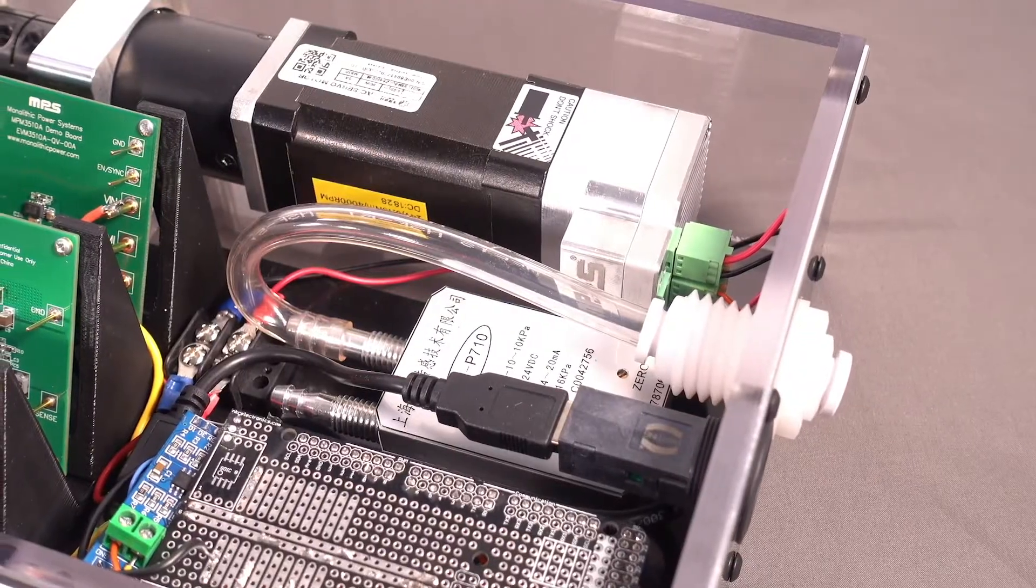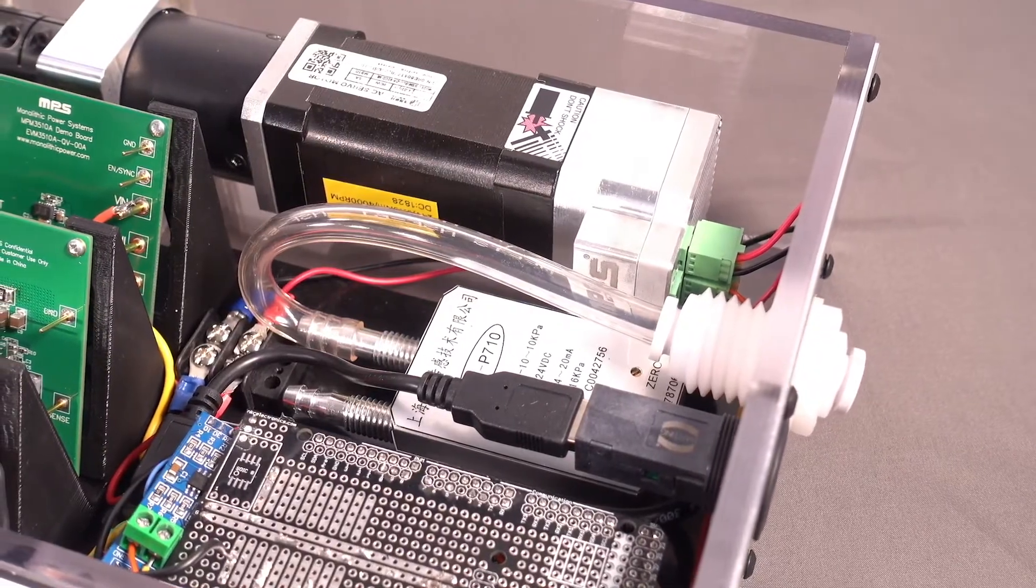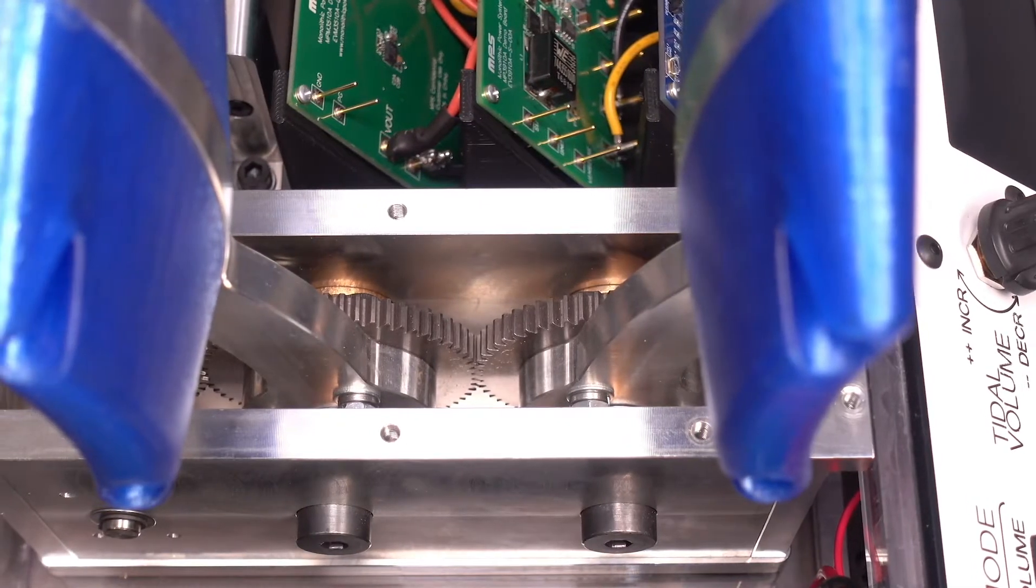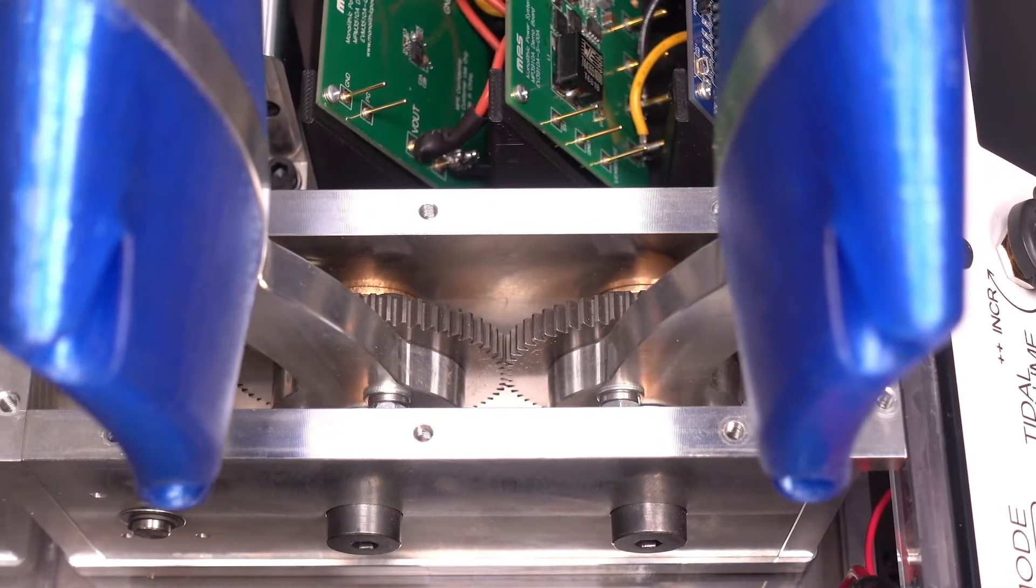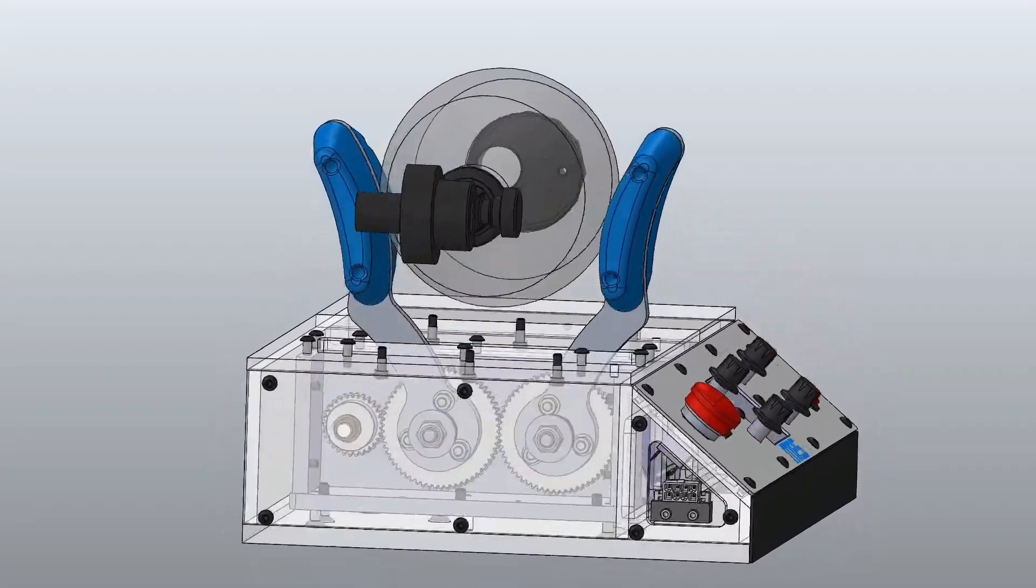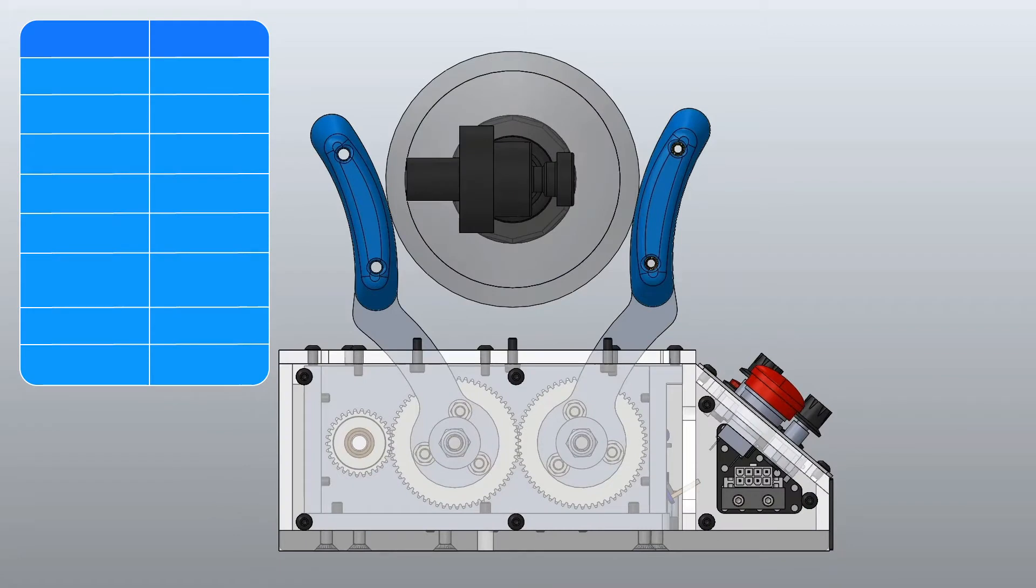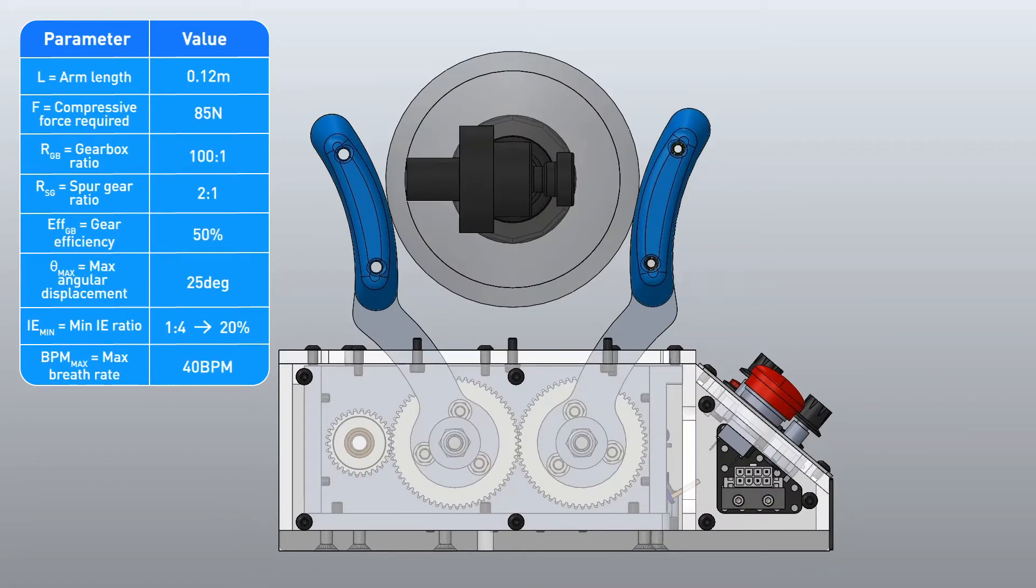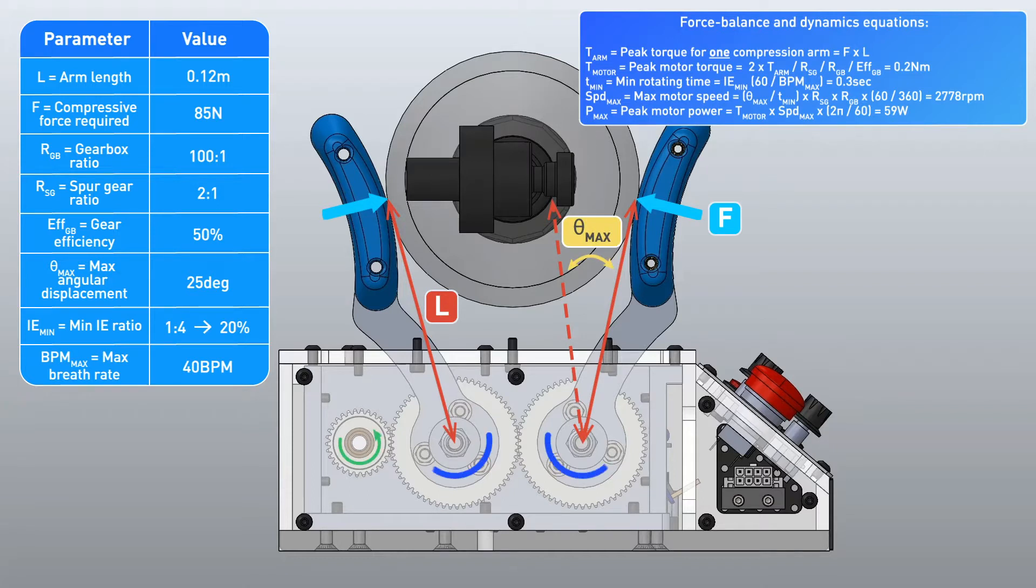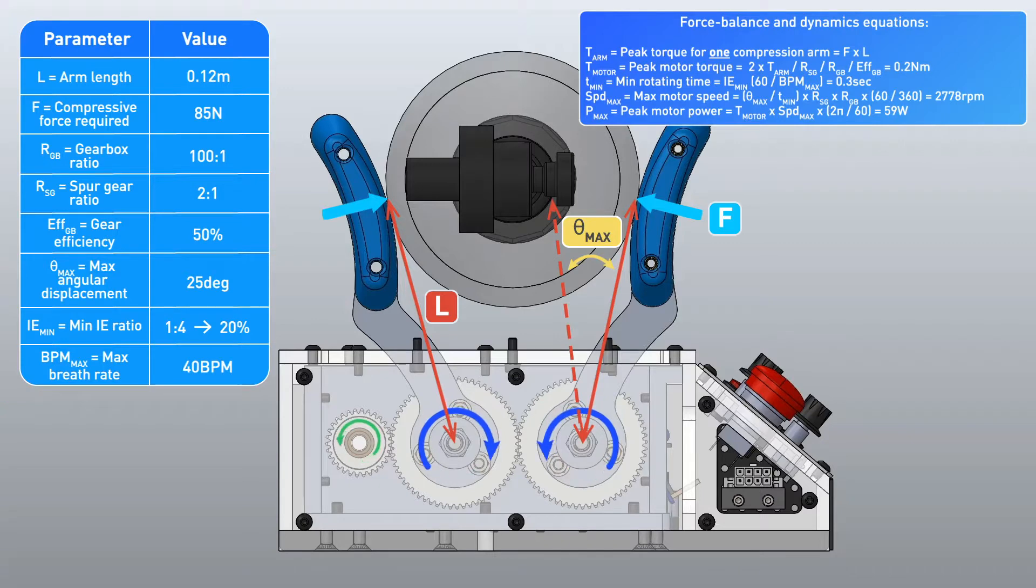An MPS smart motor paired with off-the-shelf drive gear components provides consistent and reliable motion control. Combining key medical requirements, test results, and mechanical parameters of our drive system, we can apply force balance and dynamics equations to work through calculations for the peak torque, speed, and power required by the motor.